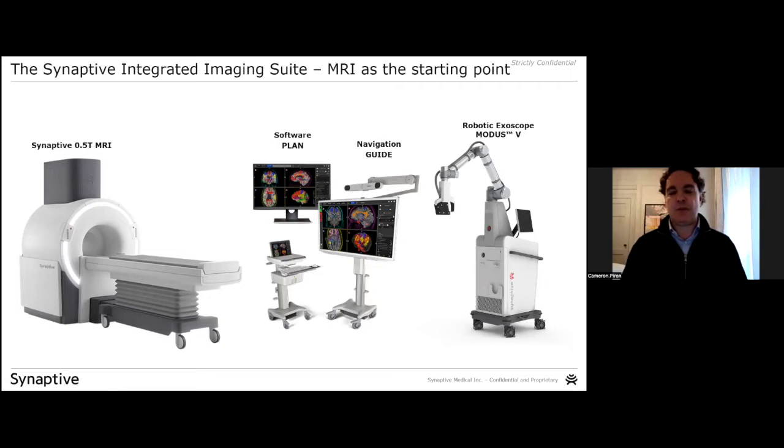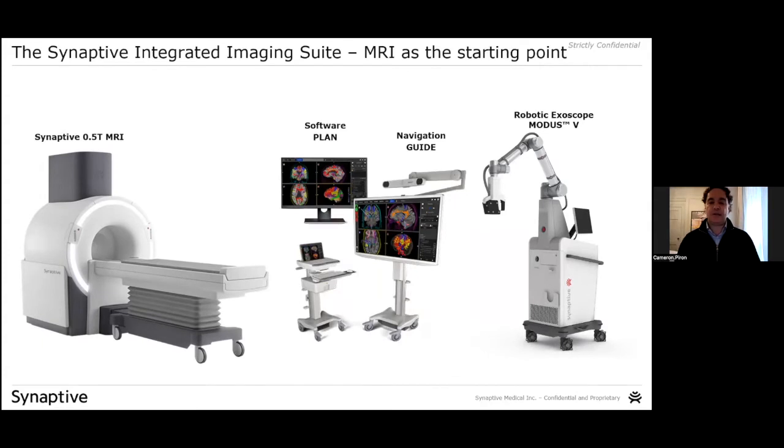And we felt we could do something very different and design the system to better enable this whole suite of intervention that's happening. This idea that you can do intervention on tumors with different methods, not just surgery, but you can deliver energy to the tumor to destroy it. Laser, heat, focused ultrasound is a big focus at Sunnybrook Hospital specifically. And the ability to guide things like radiation therapy, or the ability, as we did before in breast, to get signatures from the scanner or from the imaging to guide different drug delivery and actually be able to tweak and adjust those drugs to the patients.